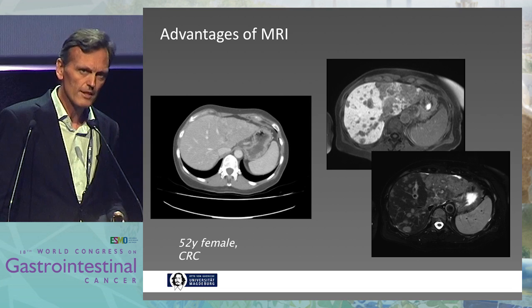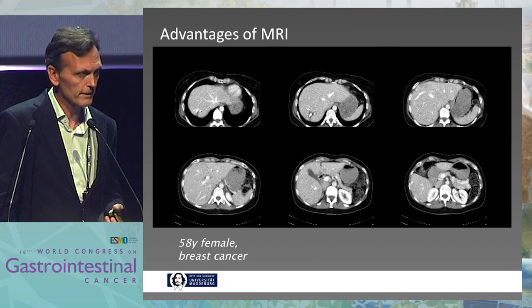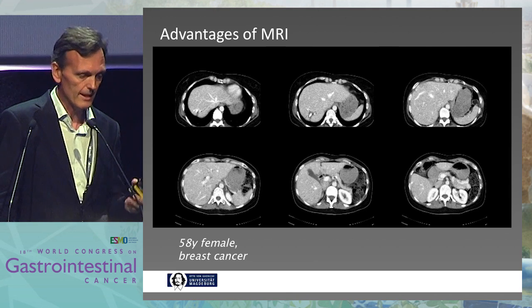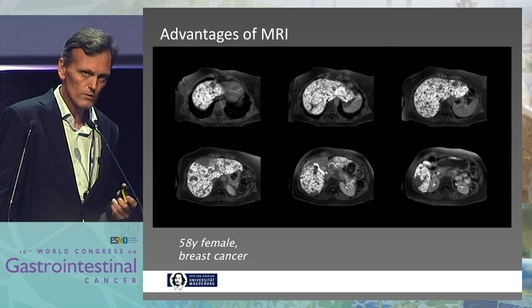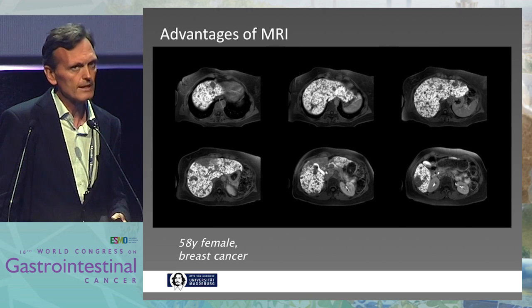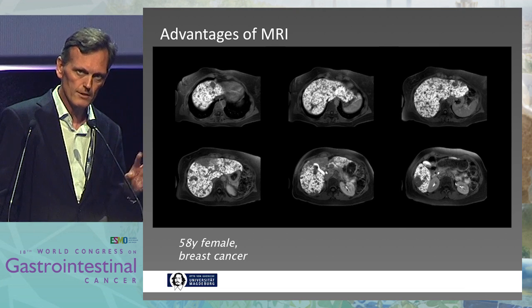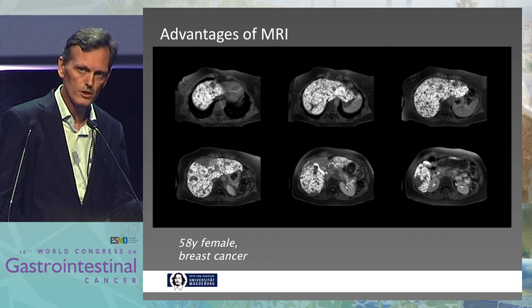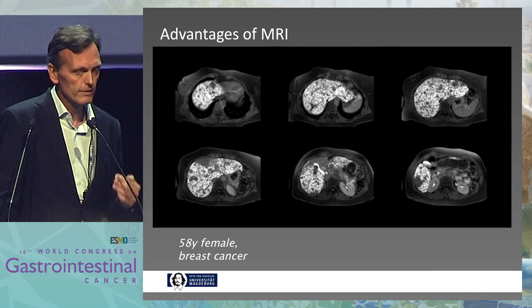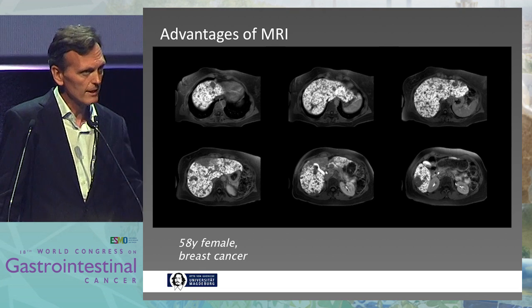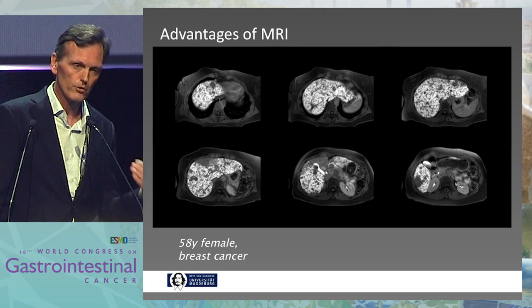The upper being the hepatobiliary imaging, the other the T2 imaging, and that's not quite rare. This is a patient with breast cancer, with CT done at the same time point as the MRI. There is not much to see on the CT. But everything that's black in that hepatobiliary imaging is tumor in a breast cancer patient. Both of these patients were scheduled for radioembolization. If you radioembolize a patient with that tumor extent and diffuse infiltration, the patient is going to die from liver decompensation very soon. This is a very important step in the workup of radioembolization patients — and not only for surgery, this is the patient where you do a laparotomy and close again.